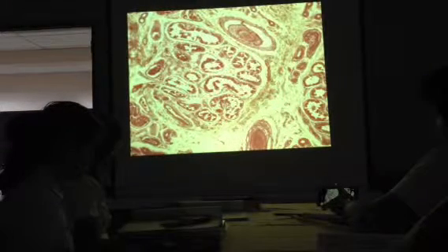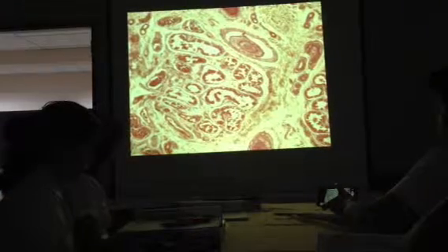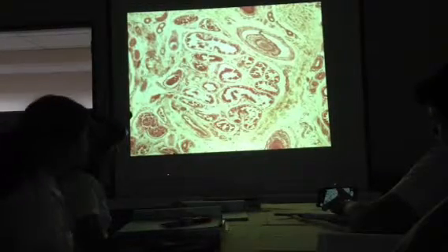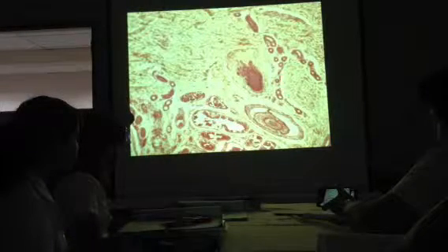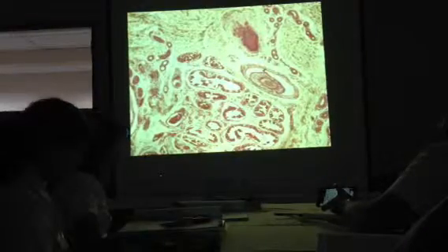Red. That is the red to pink. So that is the characteristic color of the cytoplasm of the apocrine epithelial cells. So they are larger in size and more red in color than the usual eccrine sweat glands. So eccrine sweat glands and then apocrine sweat glands.